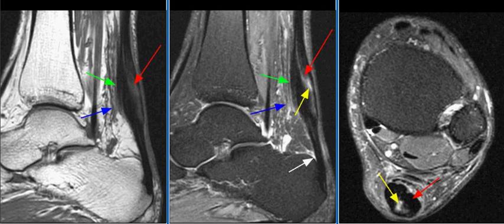This is an elderly female patient with left ankle pain. The MR examination of the ankle shows abnormally enlarged Achilles tendon with heterogeneous signal intensity, consistent with non-insertional tendinosis, with fusiform enlargement and anterior convexity of the tendon.